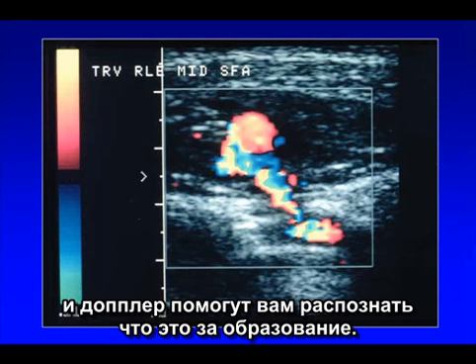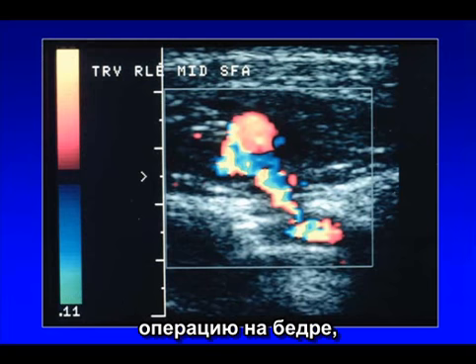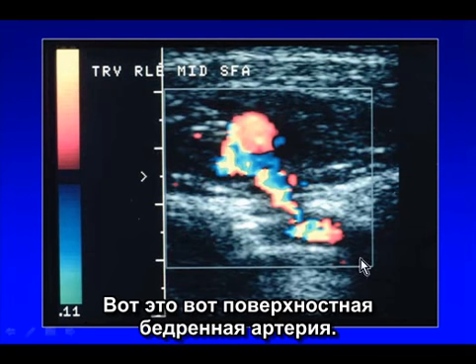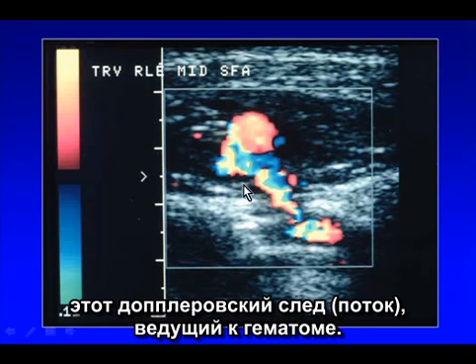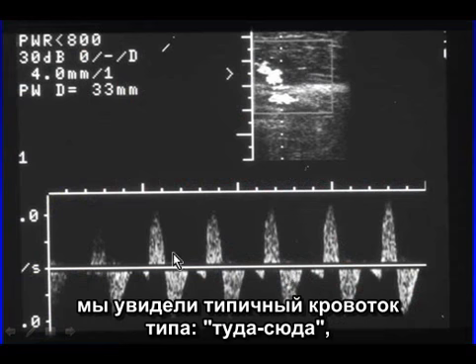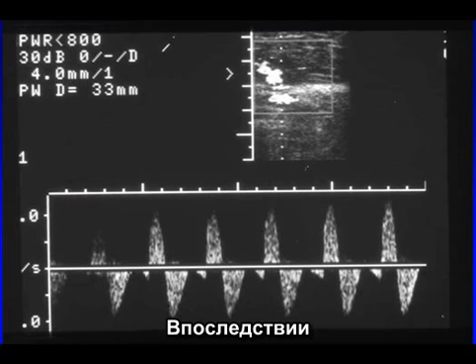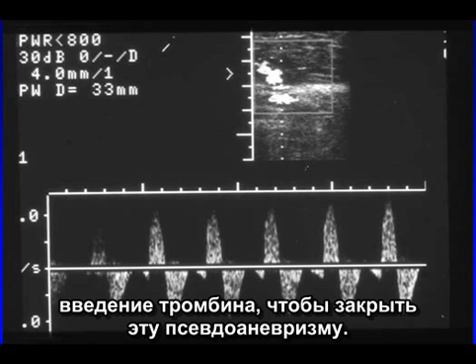Again, location and Doppler help you figure out what this lesion is. This is a patient who sustained a gunshot wound to the groin and presented with a palpable, pulsatile mass. This is the superficial femoral artery, and leading from the artery is this Doppler tract that leads into a hematoma. When we image the neck of this tract, we see the typical to-and-fro waveform that is characteristic of the neck of a pseudoaneurysm. So this subsequently went on to ultrasound-guided percutaneous thrombin therapy to close this pseudoaneurysm.